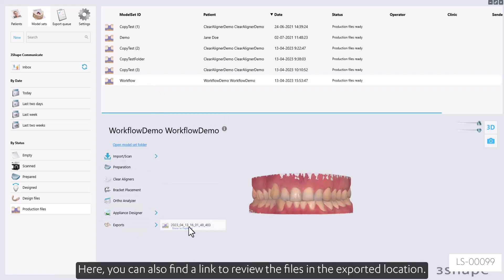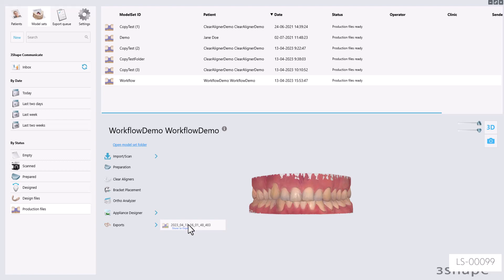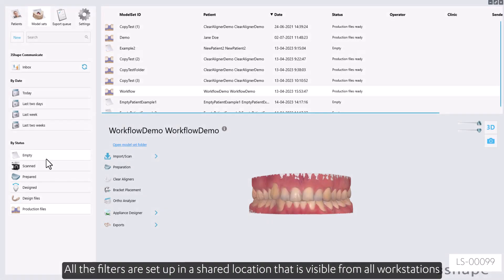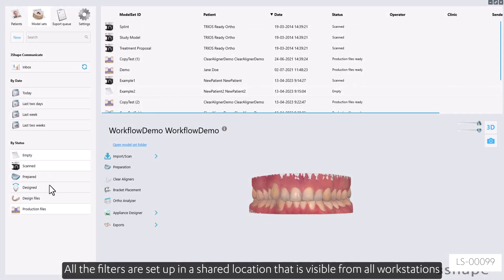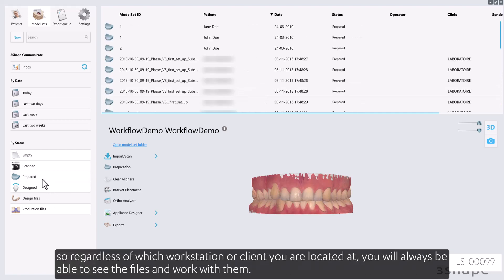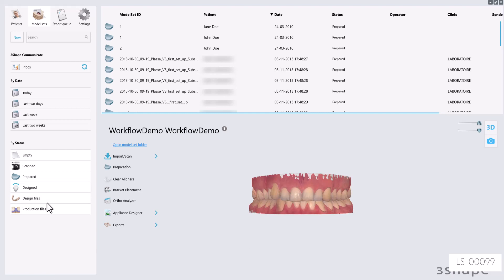Here, you can also find a link to review the files in the exported location. All the filters are set up in a shared location that is visible from all workstations, so regardless of which workstation or client you are located at, you will always be able to see the files and work with them.